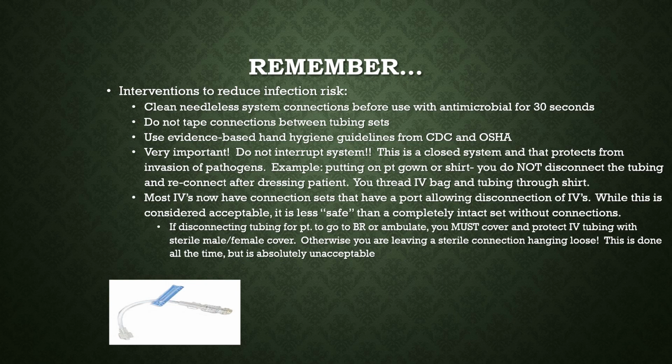And what's even worse is a lot of times when people do disconnect it, they don't even cap off each end. The end that goes into the other end, it's sterile. And so if you just disconnect two IVs and just throw the ends down, you're going to have bacteria city. So at the bare minimum, my best advice, don't disconnect the IV, even if the patient has to take the pump down the hall. That won't hurt them. Or push the pump for them if you're worried about safety and their steadiness on their feet. Don't unhook the system.